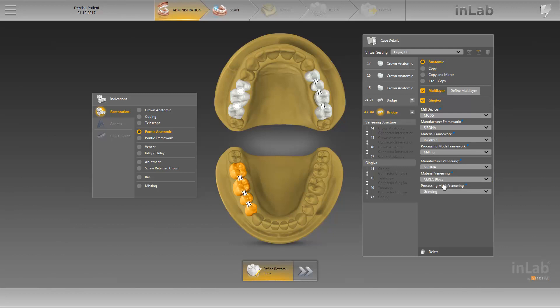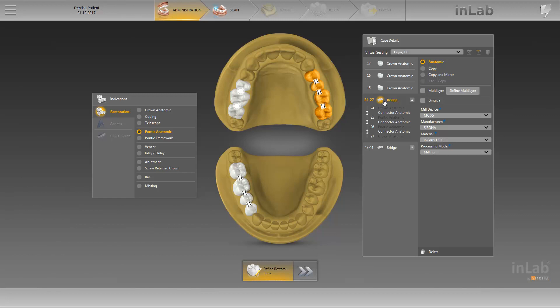Next, we will show you how you can change the type of connector using the bridge restoration from 2-4 to 2-7. We move the cursor over the connector element in the odontogram and once we click on it, the anatomic connector is replaced by a connector intersection. This kind of connector is created by the overlapping of the adjacent teeth. By clicking on the connector element once again, we can create a stress breaker. Clicking again will remove the connector element. To once again set the anatomic connector type, we click on the element again.